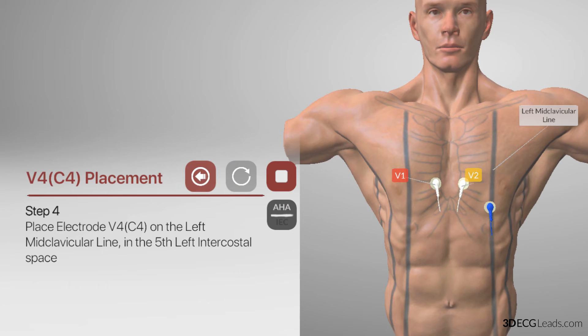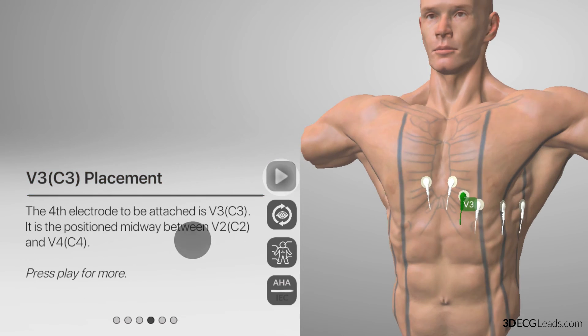The mid-clavicular line is the imaginary line that passes through the midpoint of the collarbone, also known as the clavicle, parallel to the long axis of the body. Now, press stop to move on to the next electrode to be placed, which will be V3.